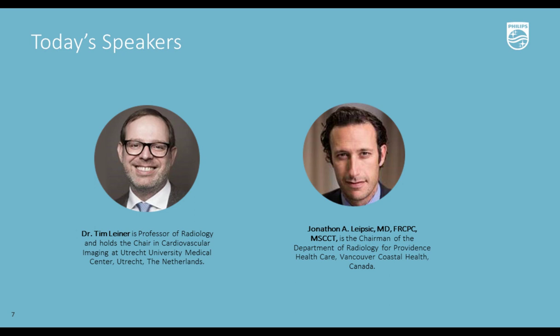Some algorithms have indeed reached the threshold of inter-observer variability, which is basically what you need to reach in order for the algorithm to be considered equivalent to if either Jonathan or myself would read a cardiac MR case. There are always small differences, but if they're small enough, then there's no problem.